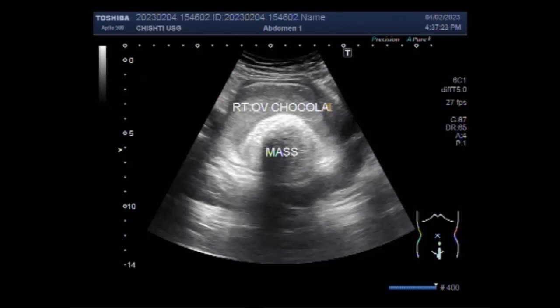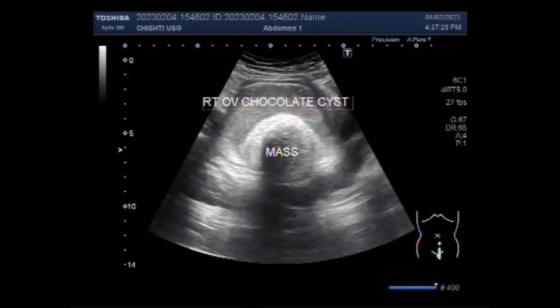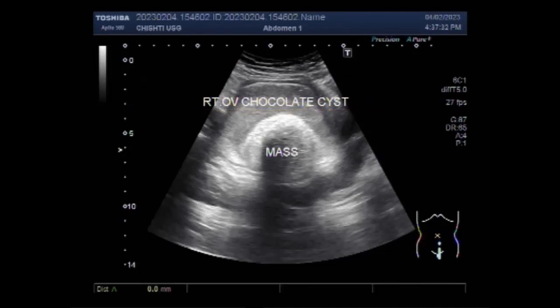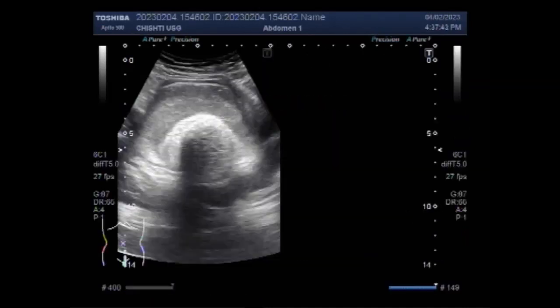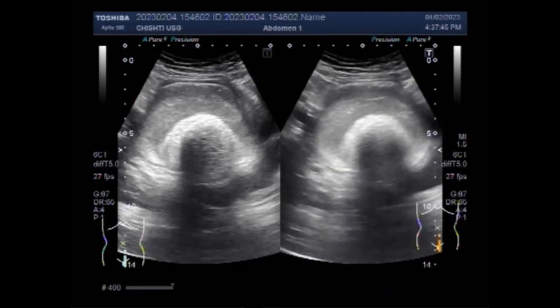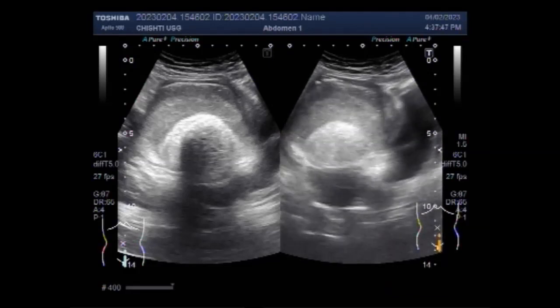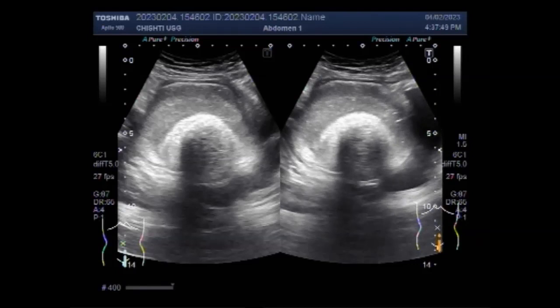But in this case there is a large mass in the caudal portion of this chocolate cyst. This mass measures about 5.8 cm x 4.9 cm — quite a large mass. The mass has homogeneous echotexture.